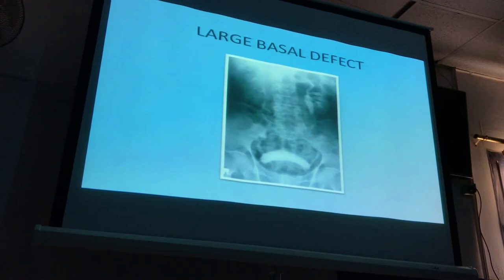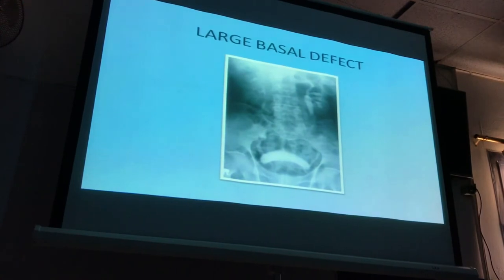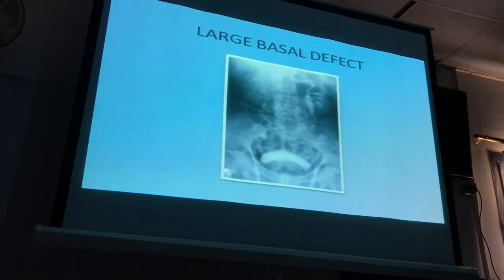This is a large basal defect. This X-ray is very important. You can see also there is left hydroureter, maybe from the back pressure and the obstruction. This is intravenous pyelography showing the pelvicalyceal system on either side. You can see the right kidney is okay and functioning well. The left kidney, there is a delayed excretion of the dye due to hydroureter. Okay? And again, there is a large basal smooth filling defect, most probably due to benign prostatic hyperplasia.